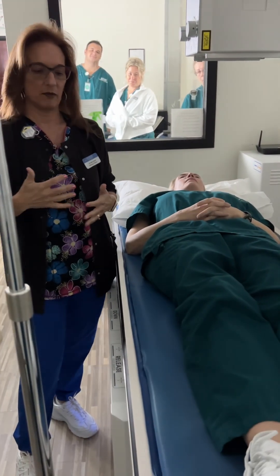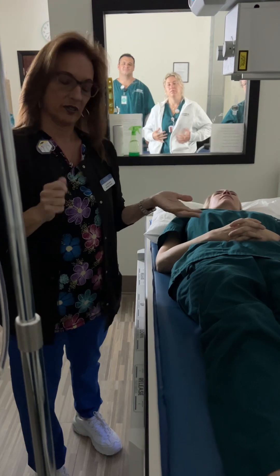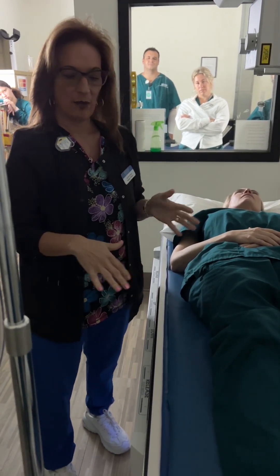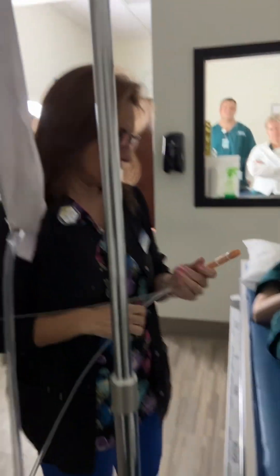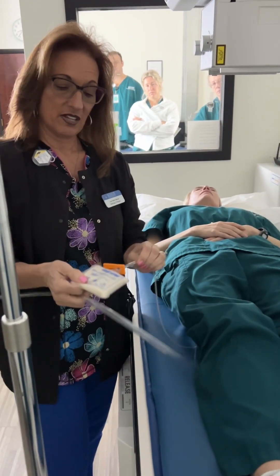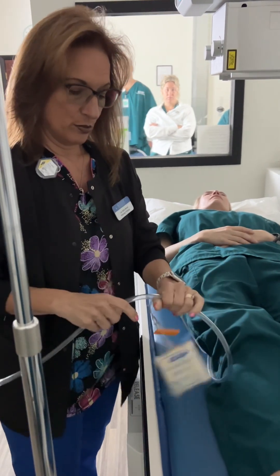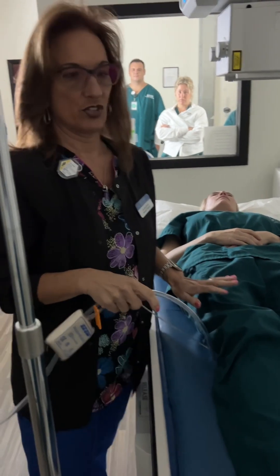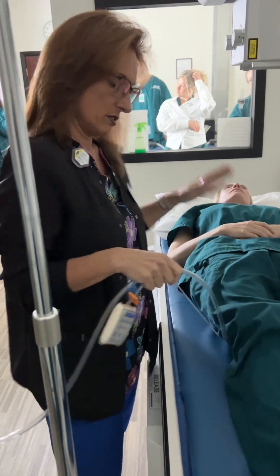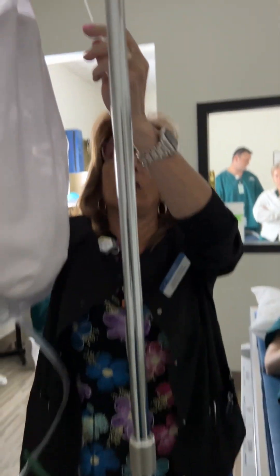At that point the radiologist comes in. We introduce the patient and the radiologist. The radiologist calls for barium on; I turn the barium on and repeat 'barium on.' Throughout the procedure, every time he calls barium on or off, I repeat that and act accordingly. I'm also watching the tubing as the patient rolls, because if the tubing gets caught and the cufflator comes off, the balloon deflates and I lose the tip. Our job is to assist the radiologist, watch the tubing, and turn the barium on and off.